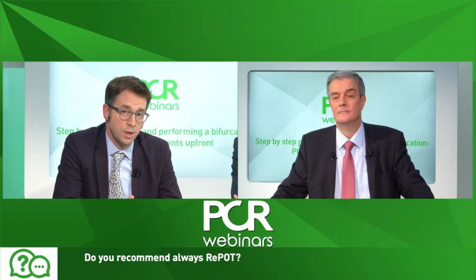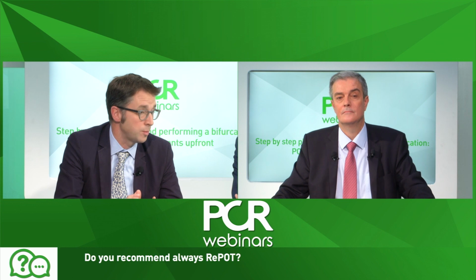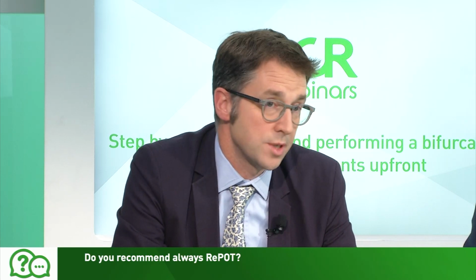Yeah. Do you recommend always repotting? So after this imaging, do you think that elliptical deformation is relevant? Always, no. Yes, I think we can see that there is a benefit of doing that in this case. So the concept being that having undertaken the KISS, you may have an elliptical deformation of the proximal vessel. And so the idea being that by then repotting, you're generating a circular main proximal vessel again, which has been shown very nicely on the bench. There's no clinical data to support it, but conceptually it seems like a nice idea. Yeah, and in this case, the left main is a very short vessel, so the ovality will not influence the outcome of the patient.